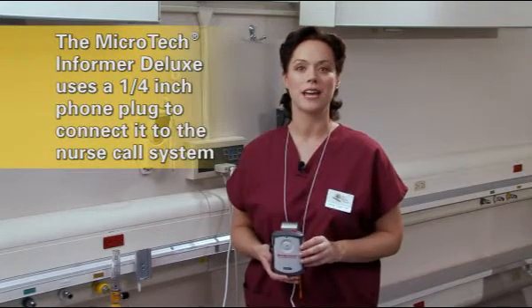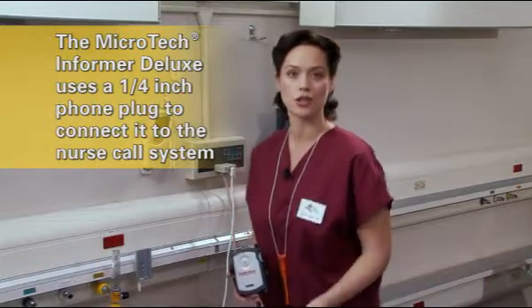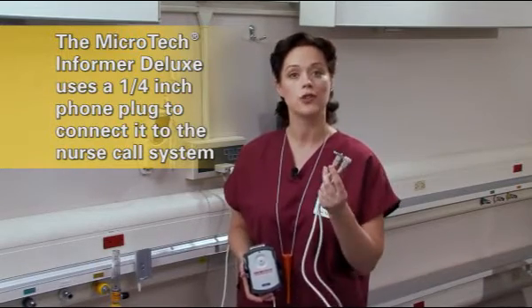The flashing lights on top of the monitor will still allow staff to see which unit is alarming. The Microtech Informer Deluxe uses a quarter-inch phone plug to connect it to the nurse call system. This is one of the more common styles of nurse call connectors.